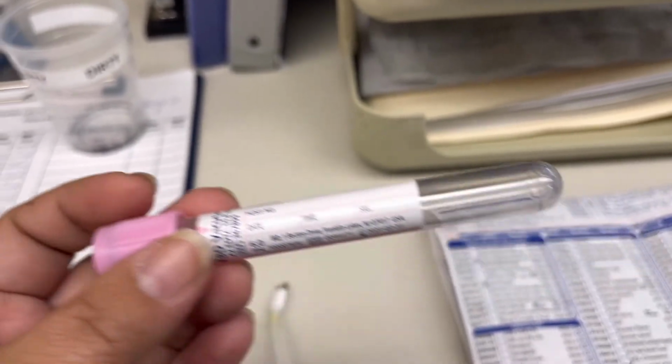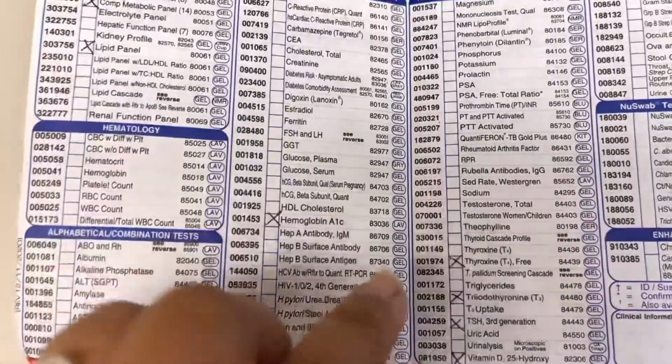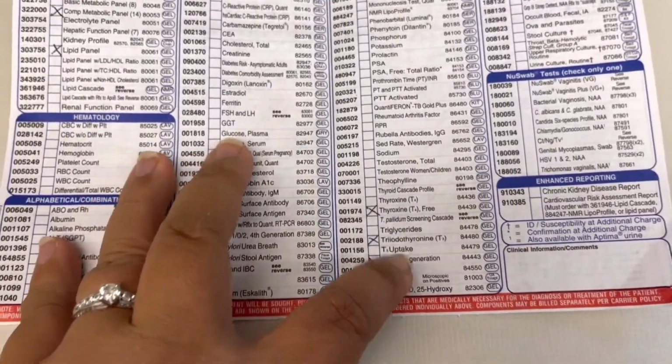Again, I'm telling you guys, it might be different from how we do it here. Always check with your company's protocol. All right, so A1C, lavender top, and all of these.